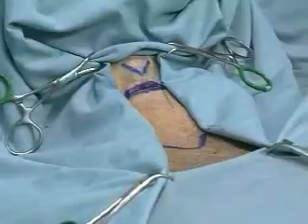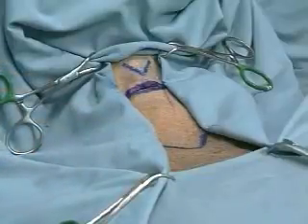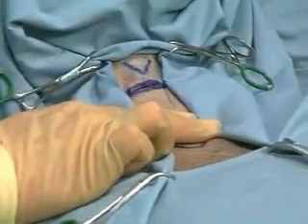Landmarks used for tracheotomy are the thyroid cartilage and the sternal notch. The incision is usually made approximately 2 finger breadths above the sternal notch. An incision of about 1 to 1.5 inches is made transversely.